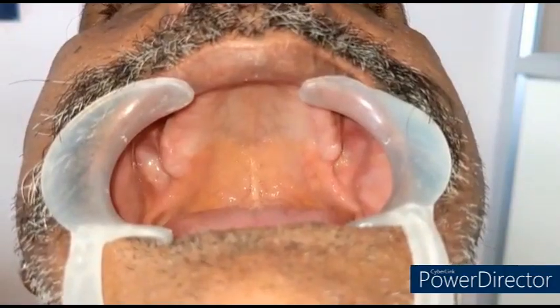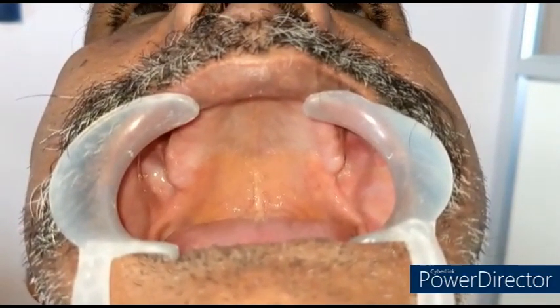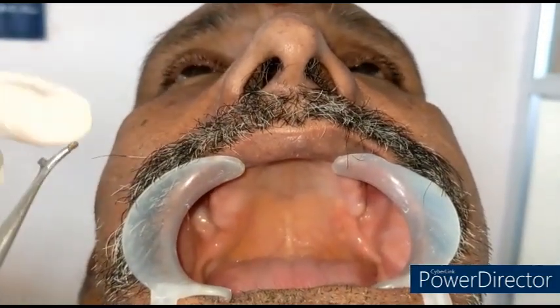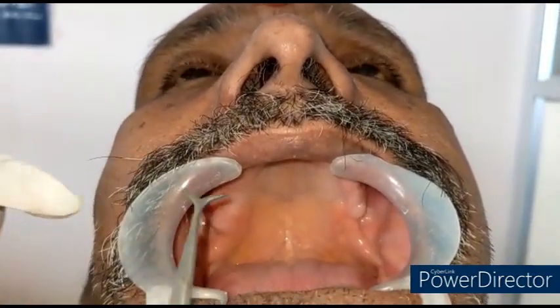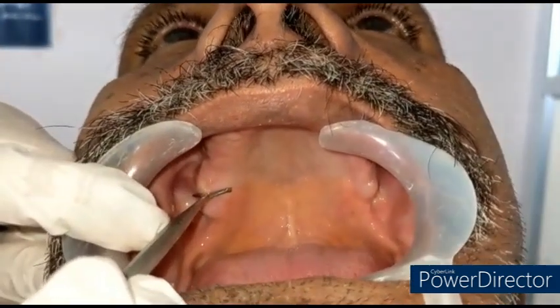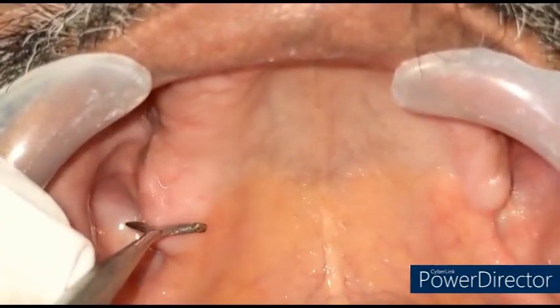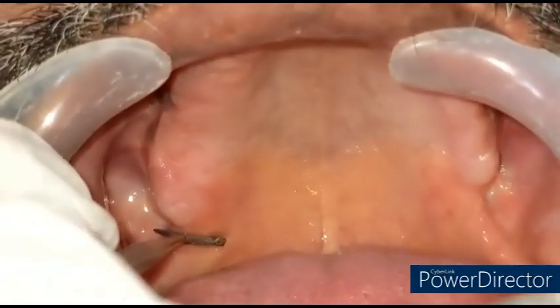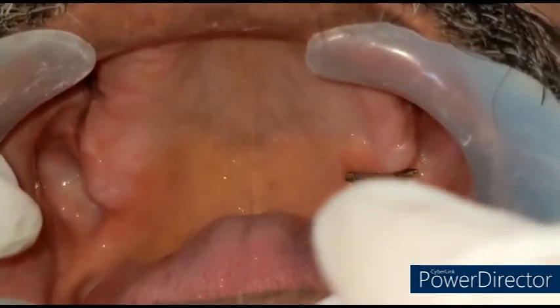So the next factor to be assessed is the extent of the PPS, posterior palatal seal area. For that we have to use this T-burnisher. The ball end should be placed over the palatal surface, and this end over the buccal surface. It will be like a T shape, and you have to place this over the crest of the ridge and slowly move it, and at one point you will see a depression. That is nothing but the hamular notch. On both sides you have to mark this extent.